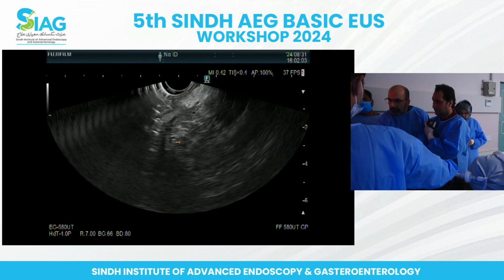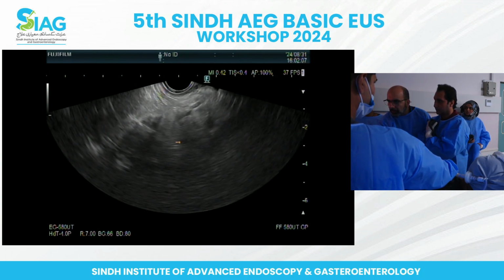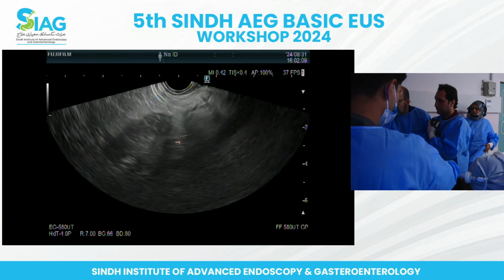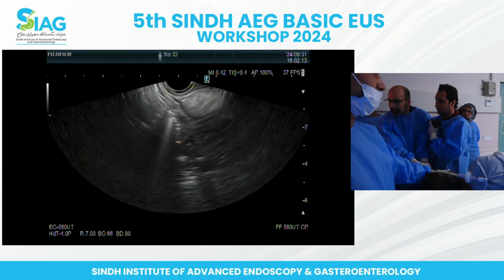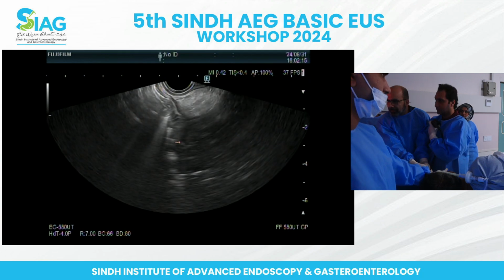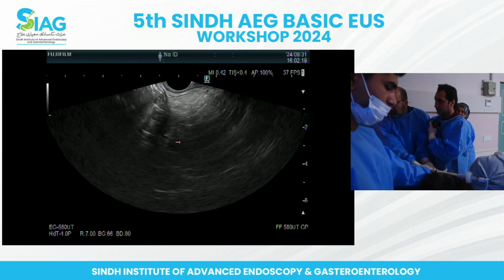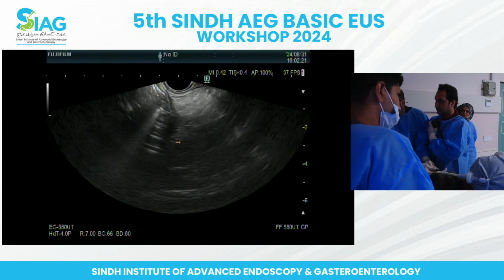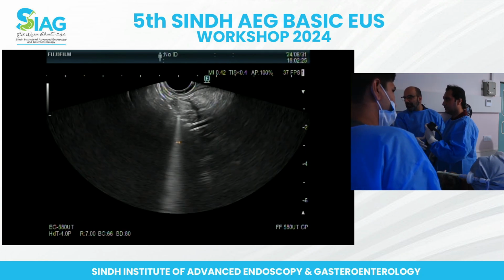Good, keep pulling back a bit. Just there, you go. It's okay to pull back a bit, right? Now go clockwise. There's the bile duct. I'm not seeing anything. We may, right there, big wheel towards you. I don't know if there's a lesion here or not. I can't tell. So let me take over because of time purposes, but that's the idea. You did good.